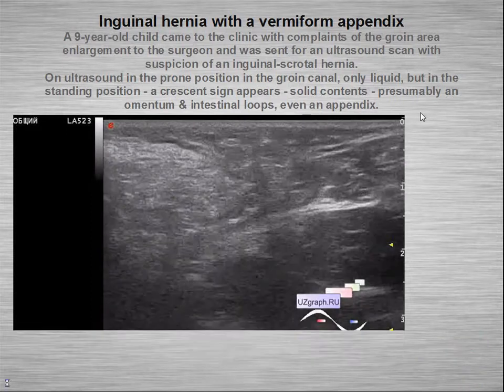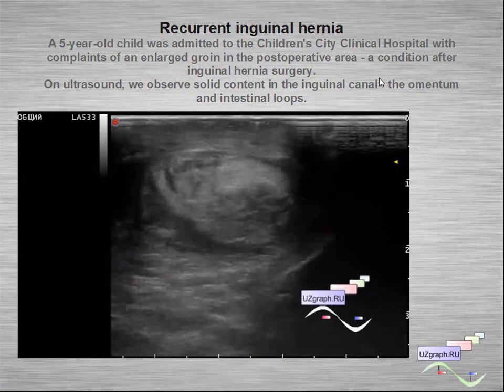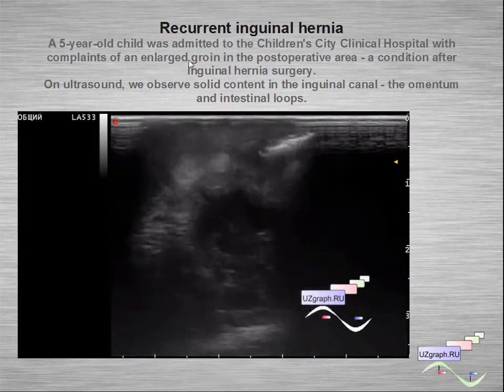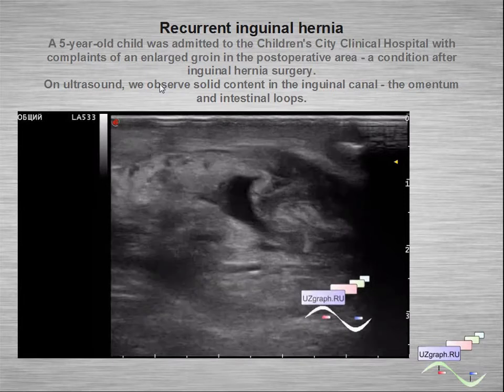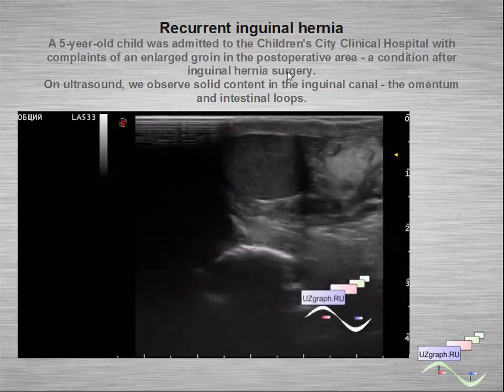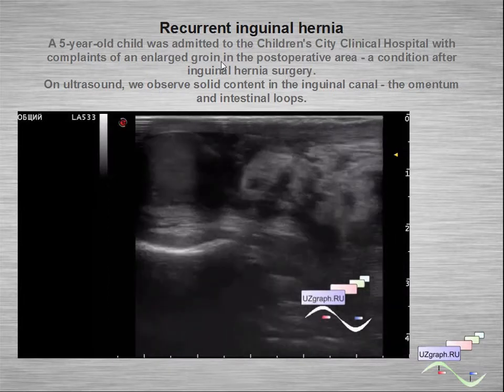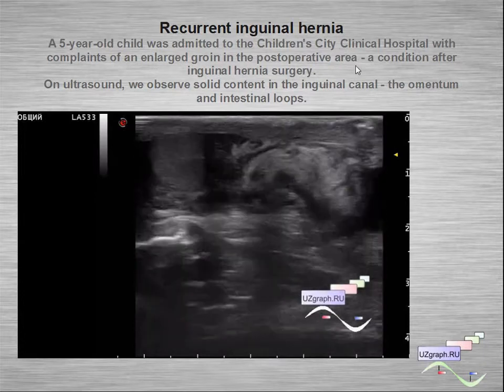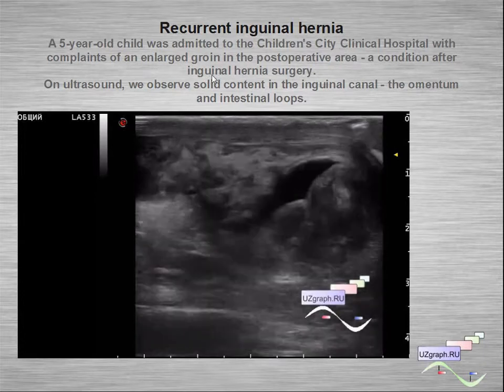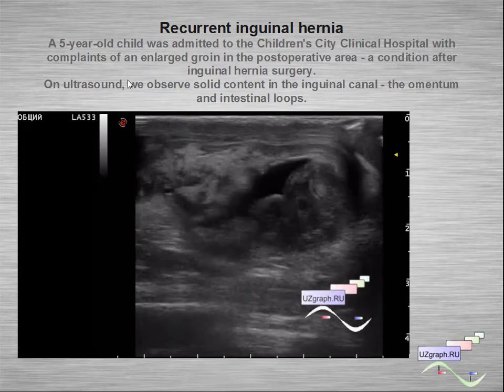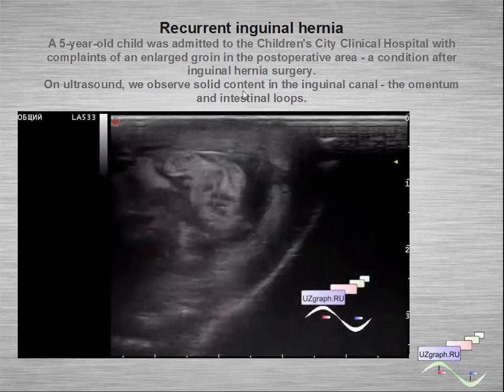Recurrent inguinal hernia: a five-year-old child in the children's city hospital presented with complaints of an enlarged groin in the post-operative area — a condition after inguinal hernia surgery. On ultrasound we can see solid content in the inguinal canal: the omentum and intestinal loops.